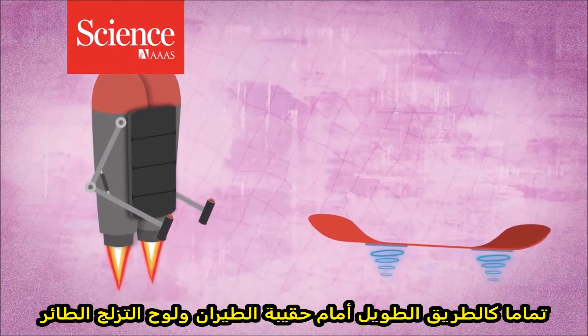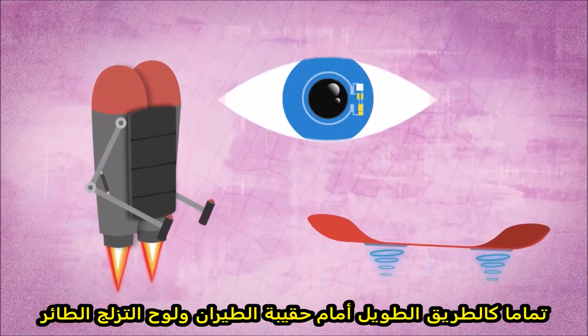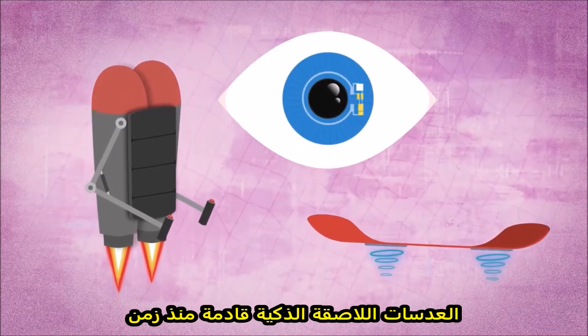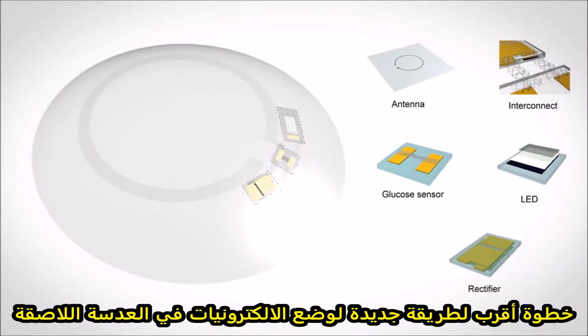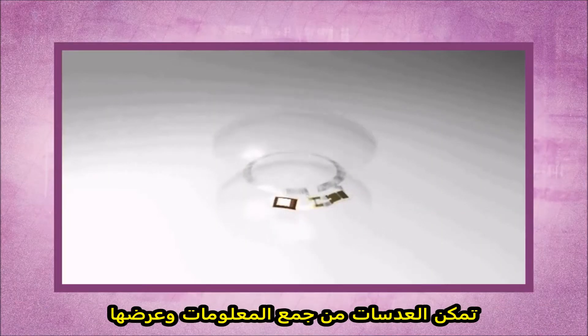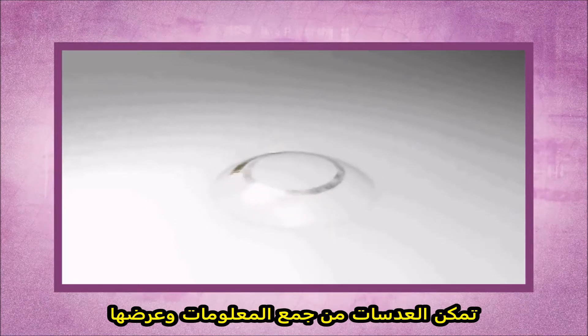Just like the long-awaited jetpacks and hoverboards of tomorrow, smart contact lenses have been a long time coming. However, a new way of putting electronics into a contact lens is one step closer to making contacts that can collect information and display it.